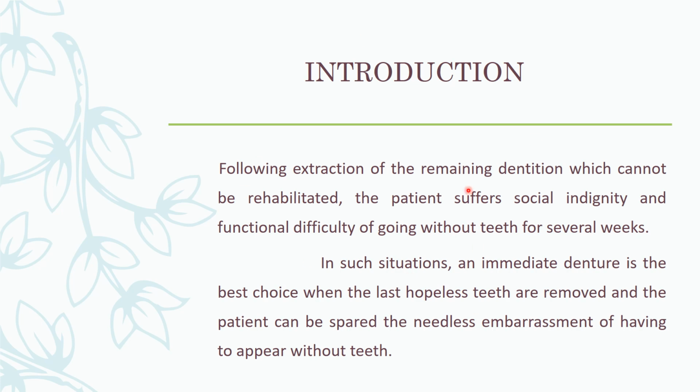Okay, coming to the introduction. Following extractions, with the remaining dentition which cannot be rehabilitated, the patient suffers from social embarrassment and functional difficulty of going without teeth for weeks. So immediate denture comes into play here, and it's the best choice for when the last hopeless teeth are to be removed and the patient can be spared of any embarrassment of not having any teeth.